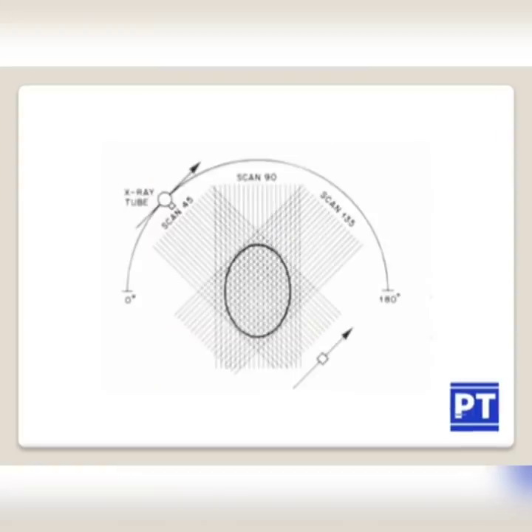Now you can see a figure. The figure is not clear, but you can also understand from this figure. The gantry moved through two different types of motion, one linear and the other rotatory. The linear motion was repeated over and over 180 times. Between each of these linear movements, the gantry rotated 1 degree.